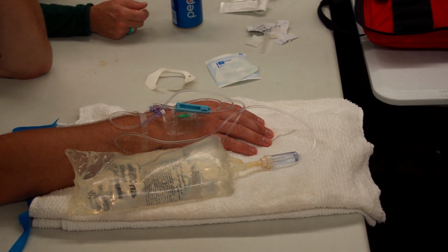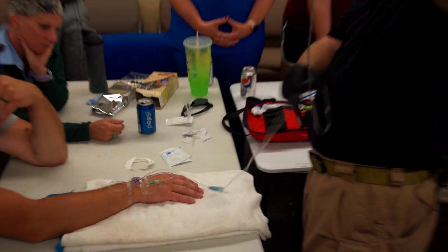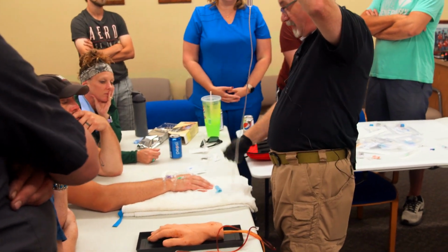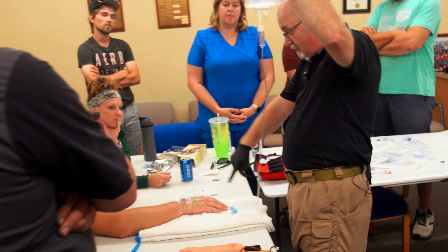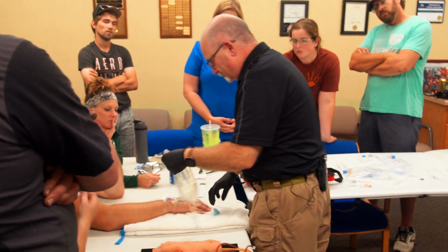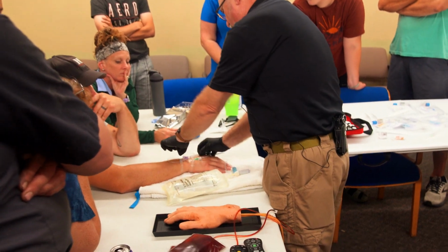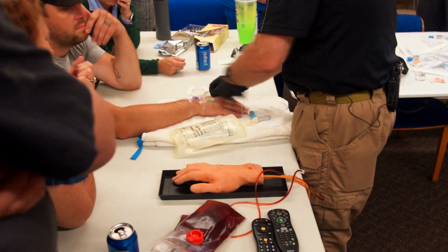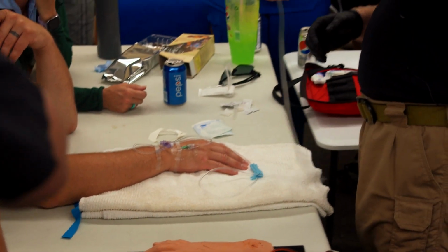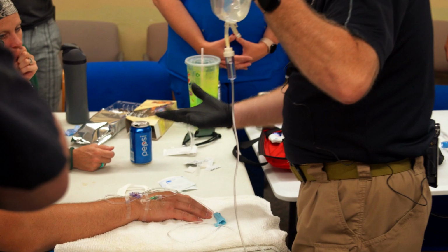Okay? So, stupid pet tricks as long as I'm sitting here. If for some strange, crazy reason we set this all up and we go, oh my God, there's air in the line all the way down, there is a little trick you could do. You can basically pinch this off and draw air out with a syringe and pull it out, but just do it the right way the first time and you're good. Other than that, that little bit of blood in here is no big deal.